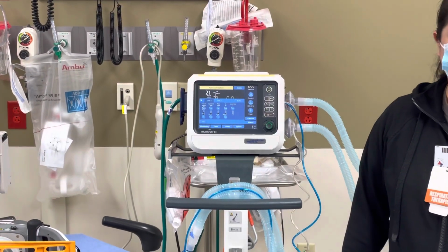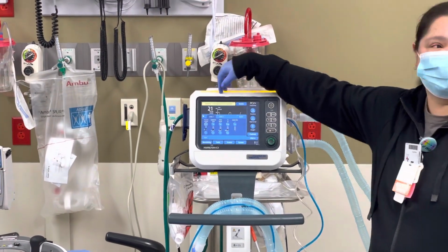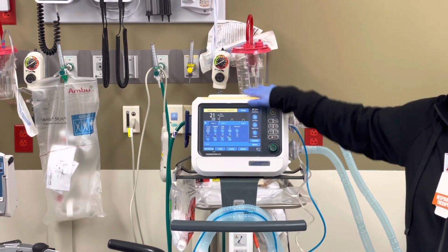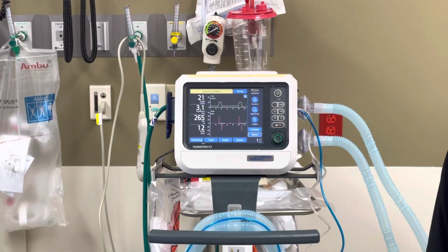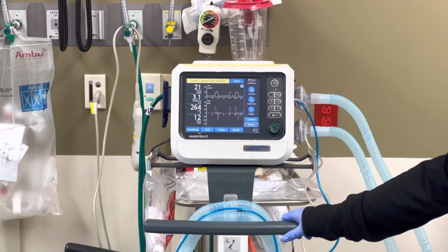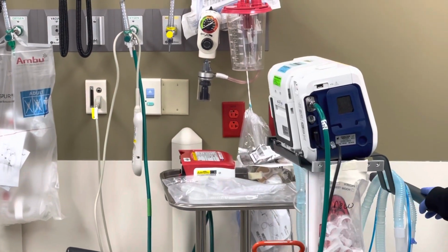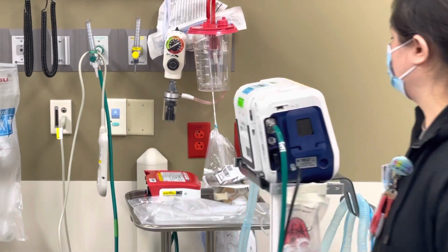Ours here always says battery replacement, and it always beeps that too. It needs to be replaced, so it probably needs to go back to biomed. We've asked forever. Every time you turn it on, it alarms. I think they even sent somebody out, and they said it's fine. But it constantly alarms when the patient's actually hooked up, and that's the only thing alarming.